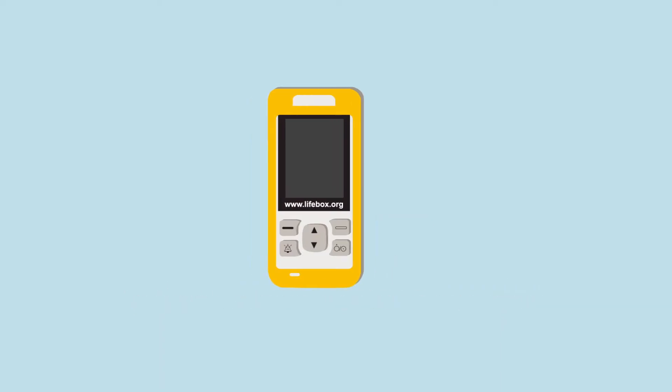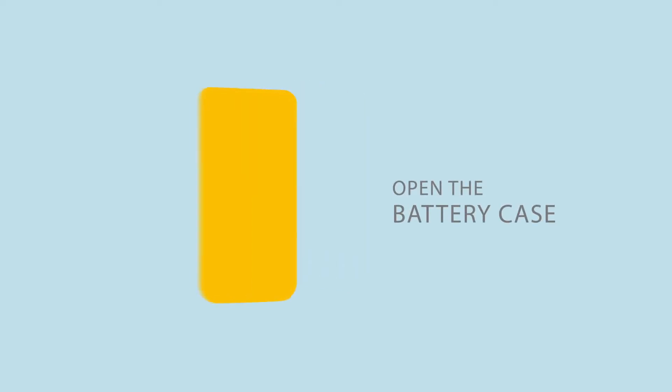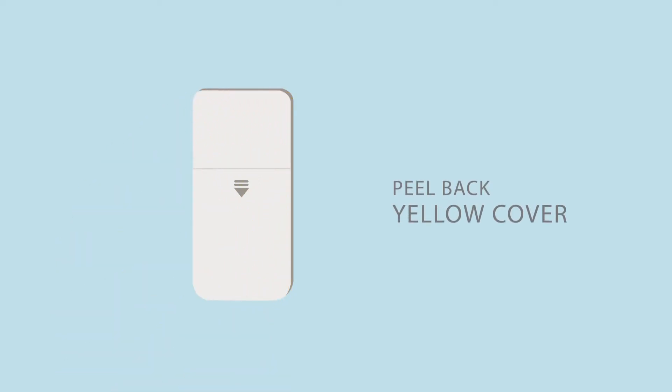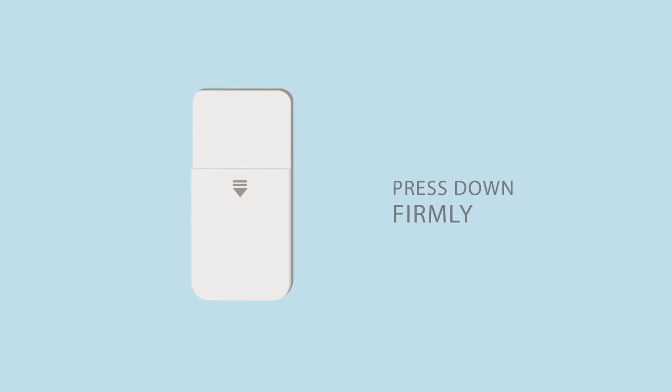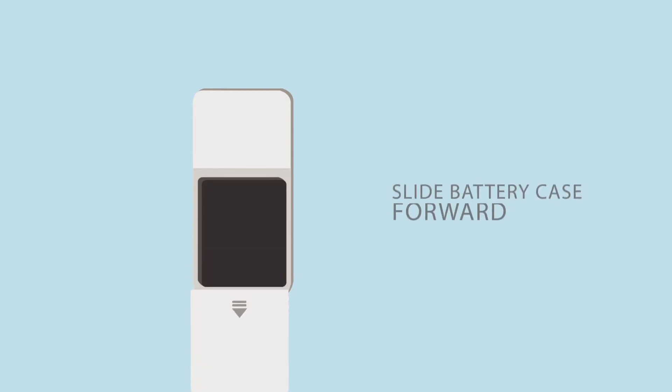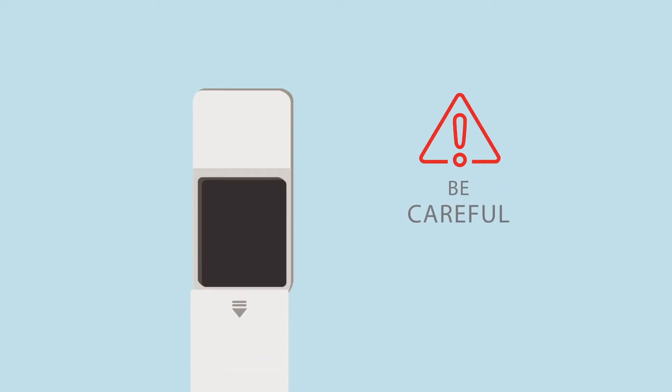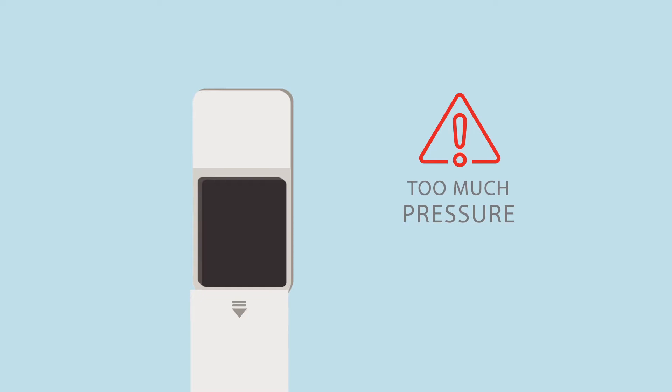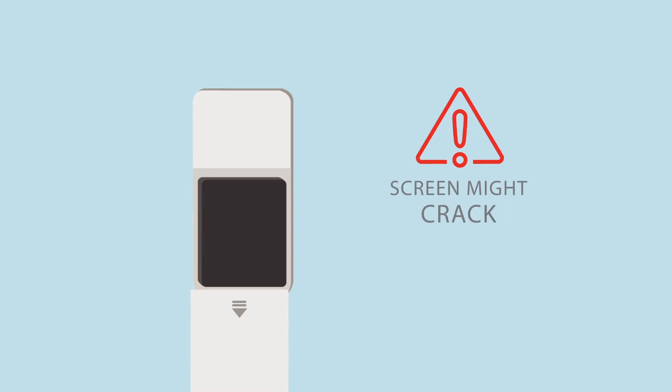To install the battery, first you need to open the battery case. Turn the oximeter so that the screen is facing downwards and peel back the yellow cover until you can see the raised arrow. Rest the oximeter screen side down on a flat surface, place your thumbs on the raised arrow, press down firmly and slide the battery case forward. Be careful not to press your fingers on the screen when you do this, too much pressure and the screen might crack.